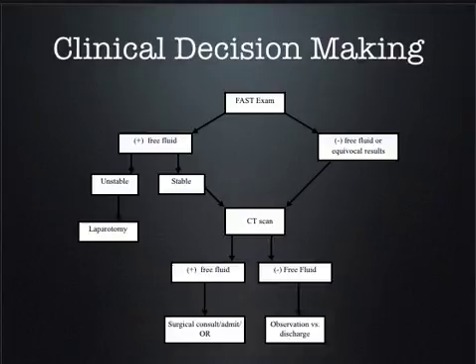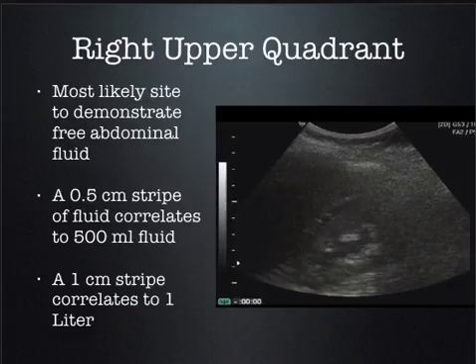All right? If they don't have free fluid and they've got abdominal tenderness, what are you going to get? A CT scan, because you want to know why their belly hurts, right? They just had trauma. So this does not obviate the need for CT scan. It complements your physical exam. It complements everything you're doing. It makes you better, faster, smarter, right? And that's one of the reasons why we're doing things.